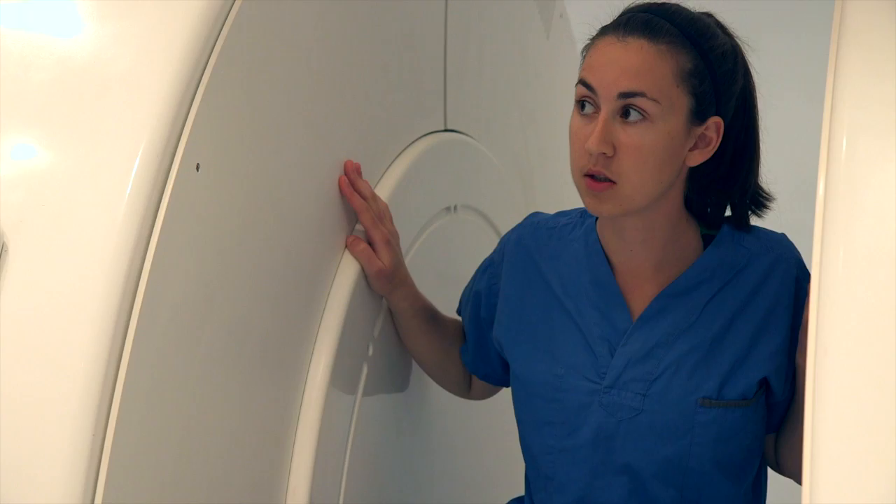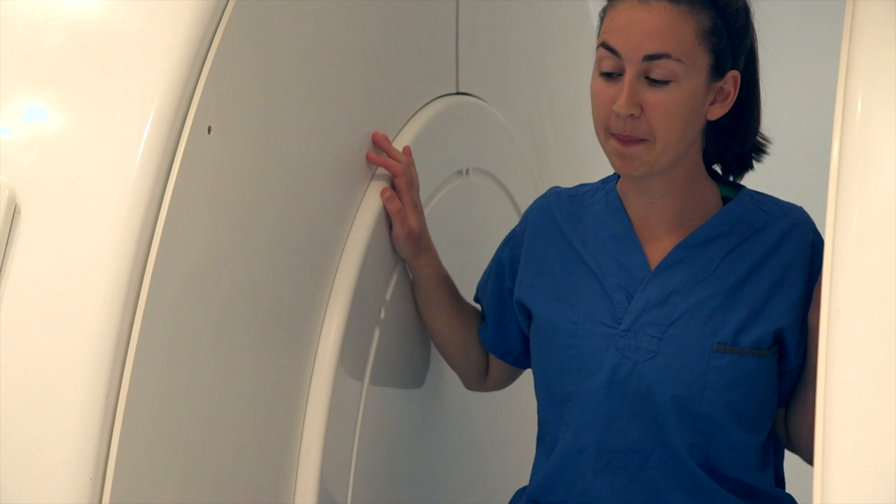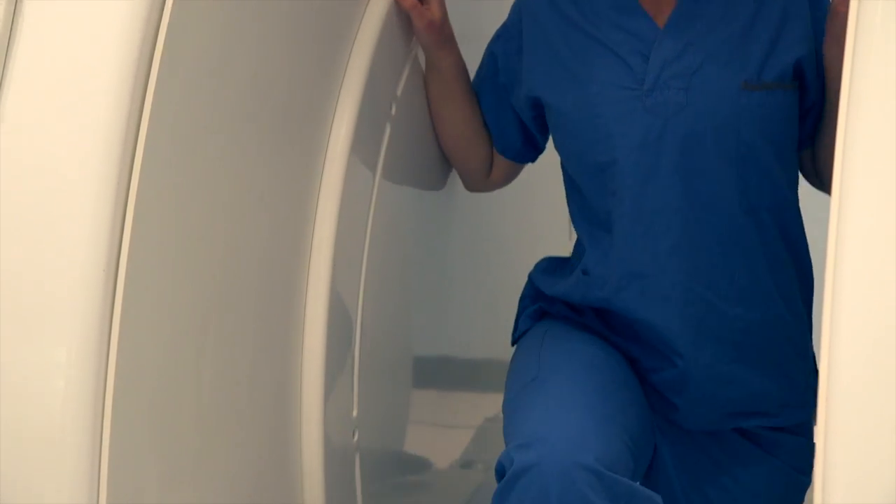I want you to start out facing straight forward and then in your lunge I want you to do a rotation to the left so that you're facing the left hand side of the scanner. That's good.